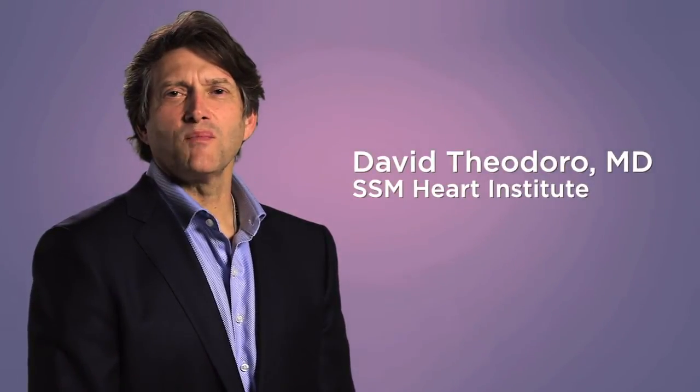Hi, I'm Dr. David Theodoro with SSM Heart Institute. I am pleased to share with you this informative animation about how we can remove a tumor within your heart minimally invasively using the DaVinci robot.